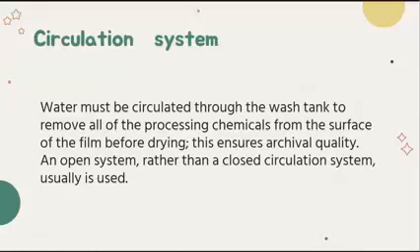The minimum flow rate for the wash tank in most processors is 12 liters per minute or 3 gallons per minute. Okay? So what I'm trying to say here is that wash water must not be recirculated, but developer and fixer can be circulated, right? Compared to the developer and fixer, which can be agitated or mixed, so that means when you mix or circulate a solution, it can be used again and again and again, okay? But with wash water, that's not the case. Okay, we are using an open system.